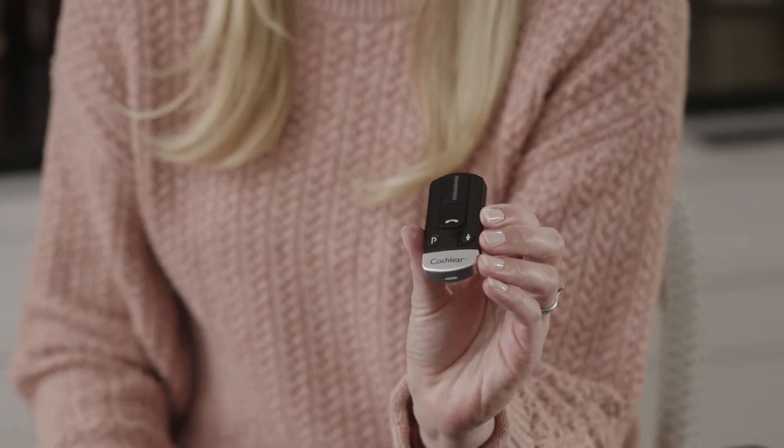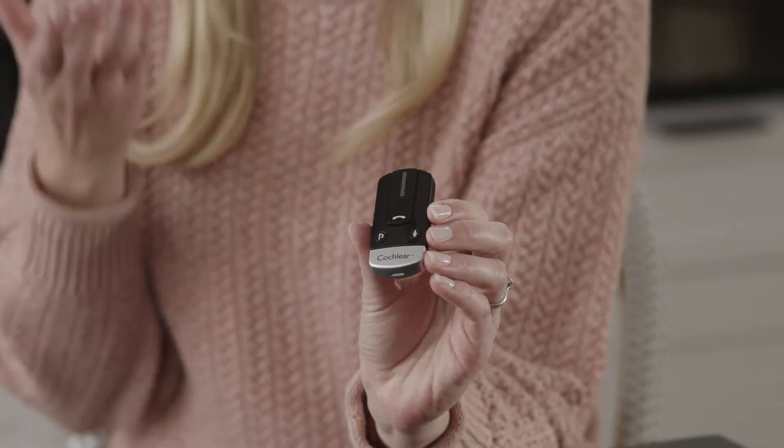While many recipients enjoy streaming audio from their phone to their processor using the direct connectivity feature, if you prefer a hands-free option while talking on the phone, you can always leverage the Cochlear Wireless Phone Clip. The built-in microphone will transmit your voice so you don't have to hold your phone in your hand.